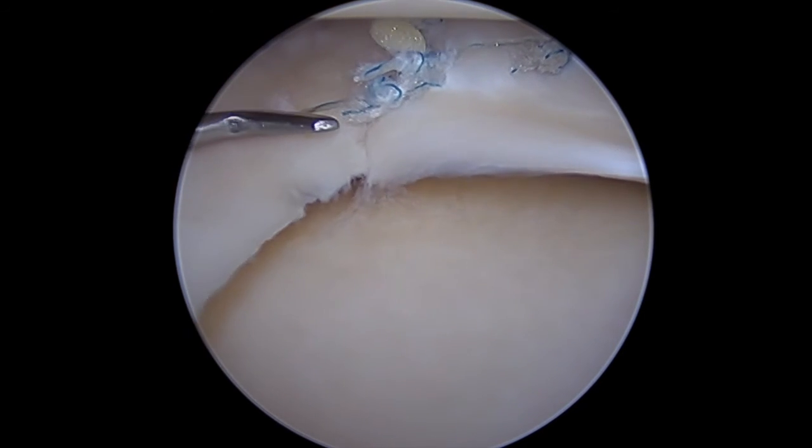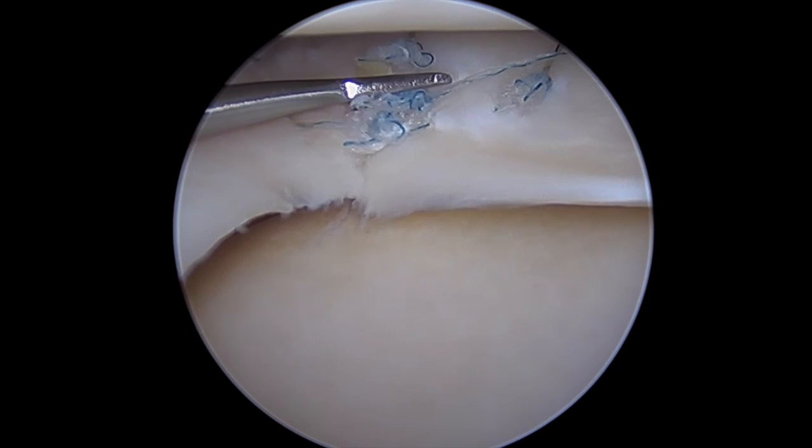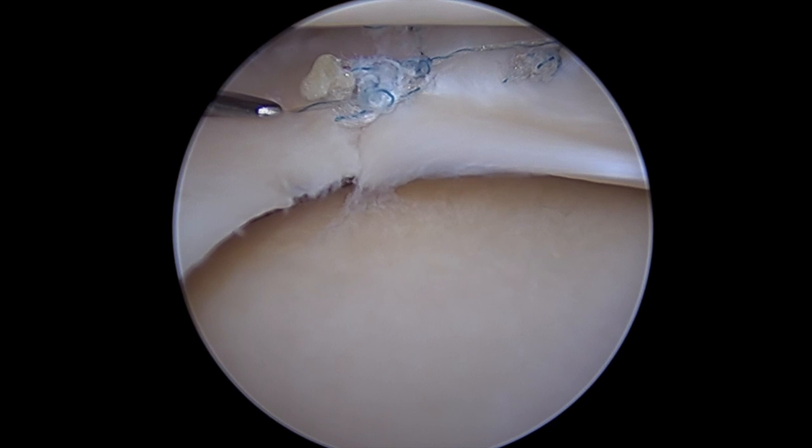Once you've got a nice repair, go ahead and cut the suture tails. You can see we've got excellent approximation of the radial split, vertical split, what we assume is an internal horizontal cleavage, and the meniscal capsular junction tear.